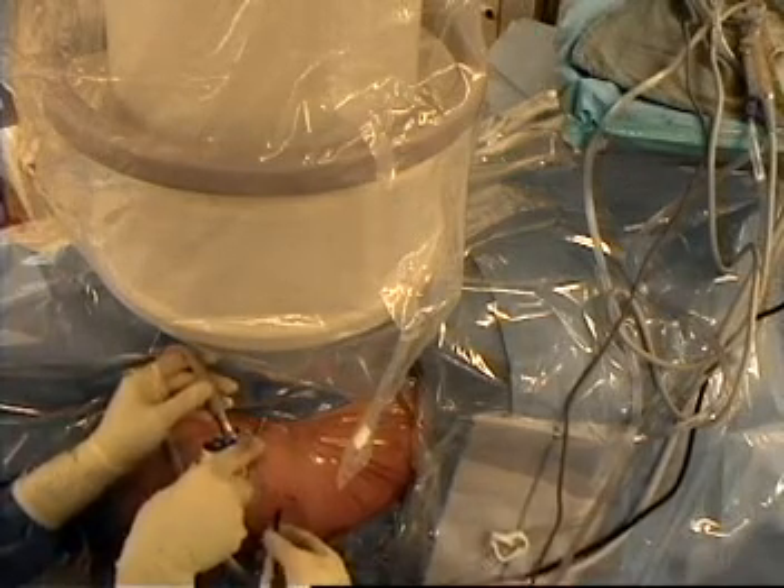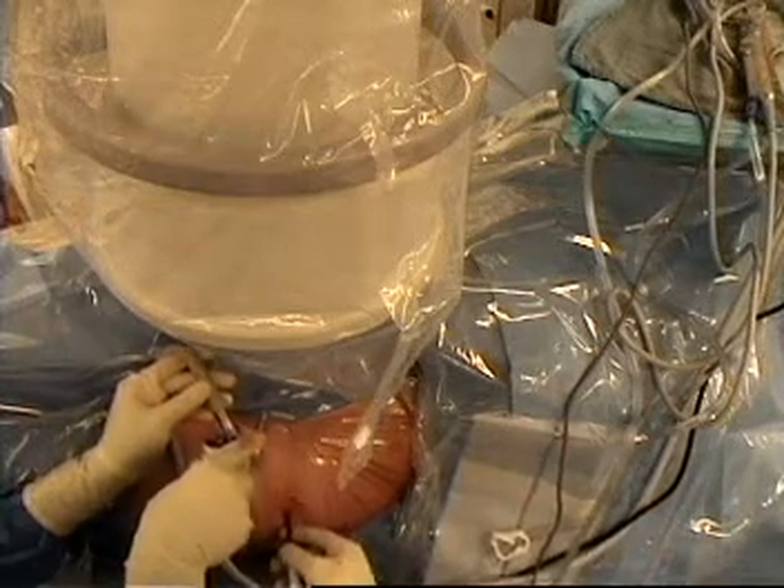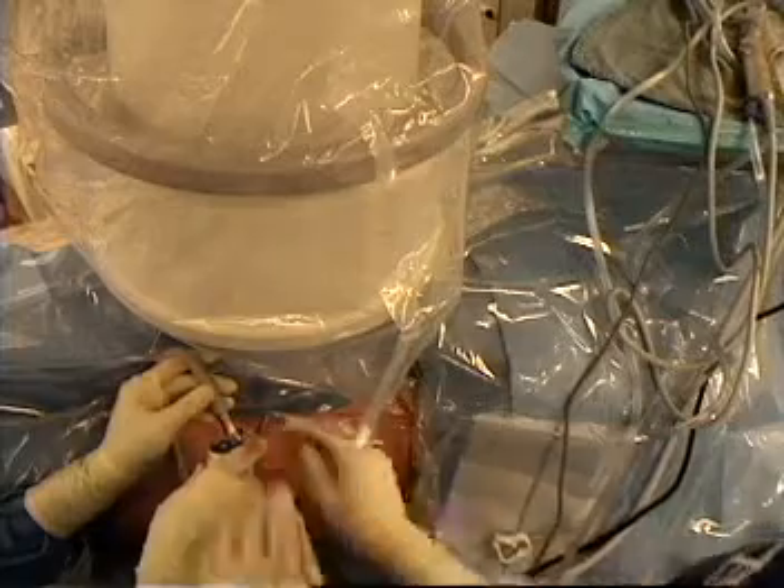Now you can see this is where your labral tear is. That is pretty obvious. You can see it is separating all the way through here. We are going to clean that off. The rest of your cartilage looks really good.